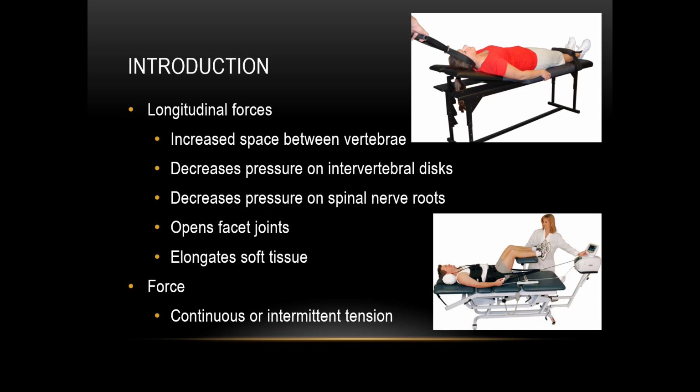The longitudinal forces can increase space between vertebrae, decrease pressure on intervertebral discs, decrease pressure on spinal nerve roots, open facet joints, and elongate soft tissue. Traction forces can be applied with either a continuous or an intermittent tension.